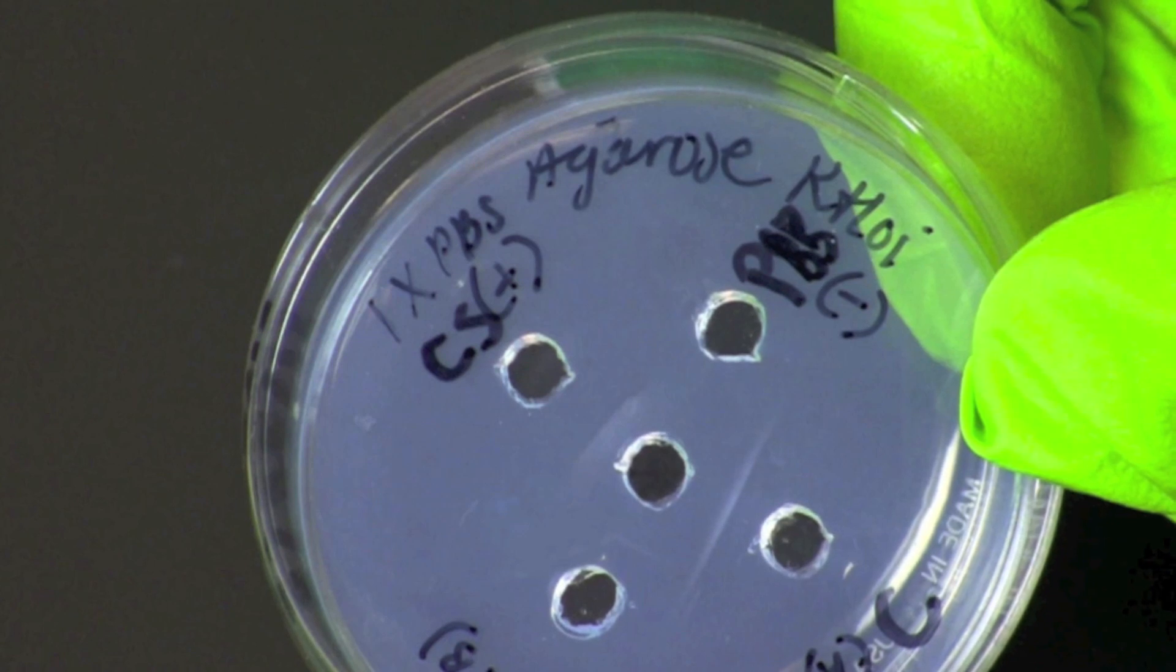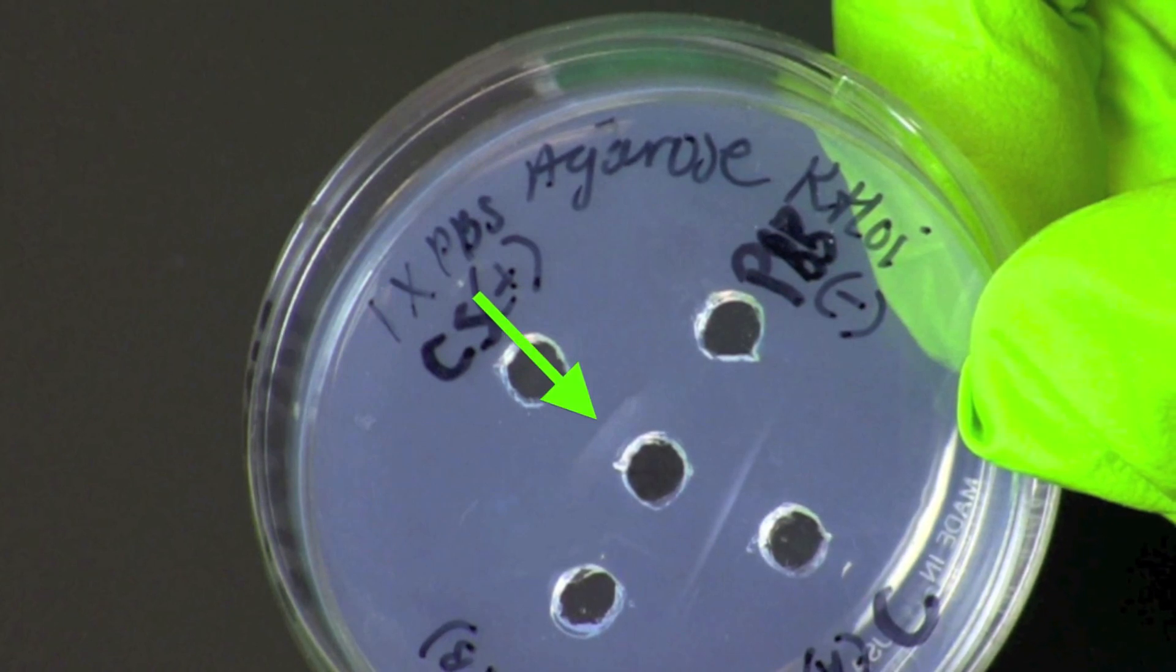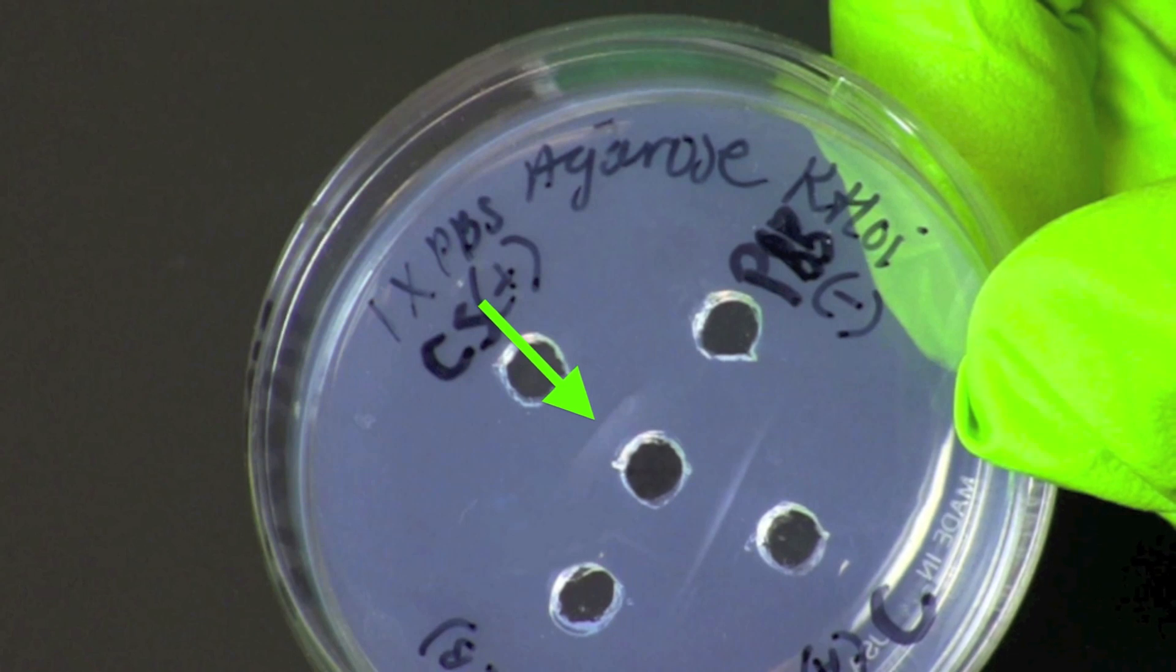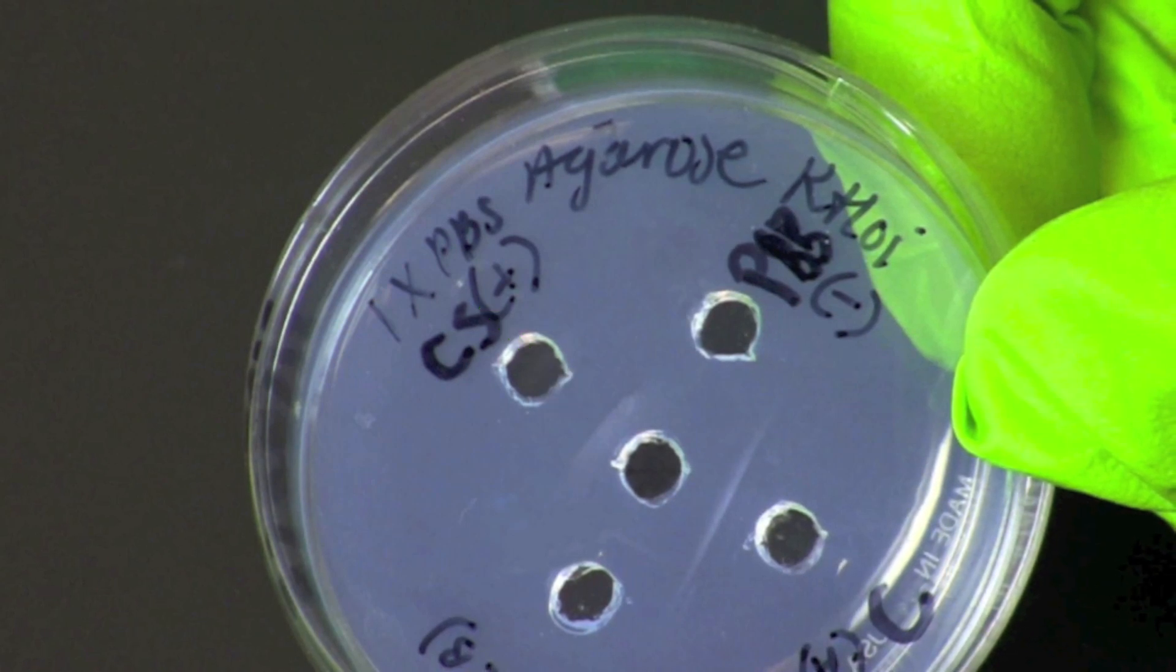Examine the plates each day until a visible white line has formed in the area between the hole where the positive control was added and the hole where the anti-chicken antibodies were added.